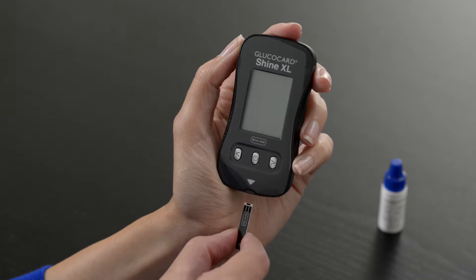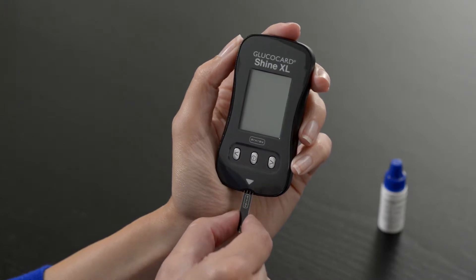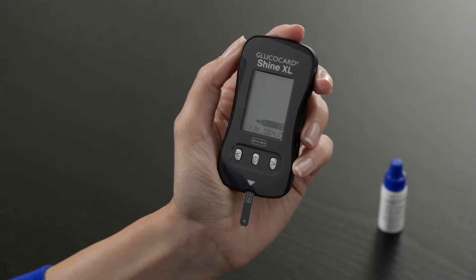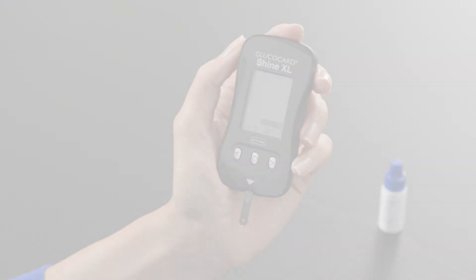Insert a test strip with the contact bars facing up into the meter. The apply blood sample symbol will appear. You are now ready to perform a control solution test.